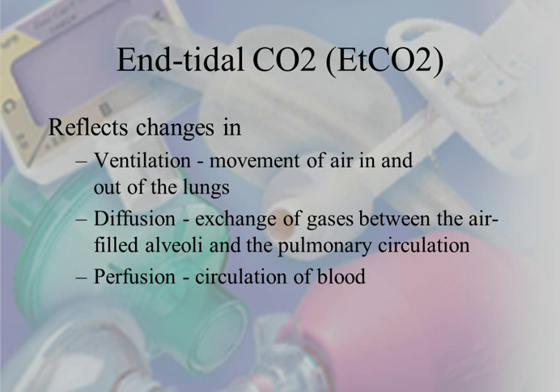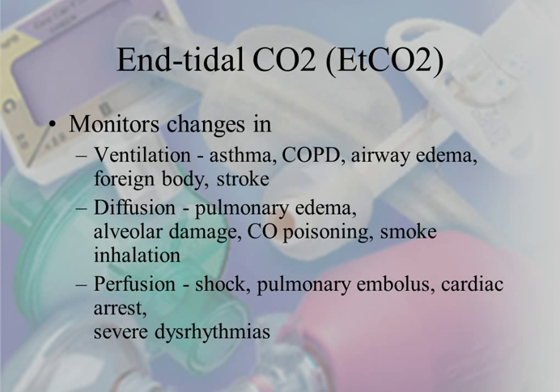All right, remember that end-tidal CO2 reflects changes in ventilation, so the movement of air in and out of the lungs. Diffusion, which is the exchange of gases between the air-filled alveoli and the pulmonary circulation. And then perfusion, which is circulation of blood. So end-tidal CO2 reflects the changes in ventilation, diffusion, and perfusion. So monitor your changes in ventilation, diffusion, or perfusion.